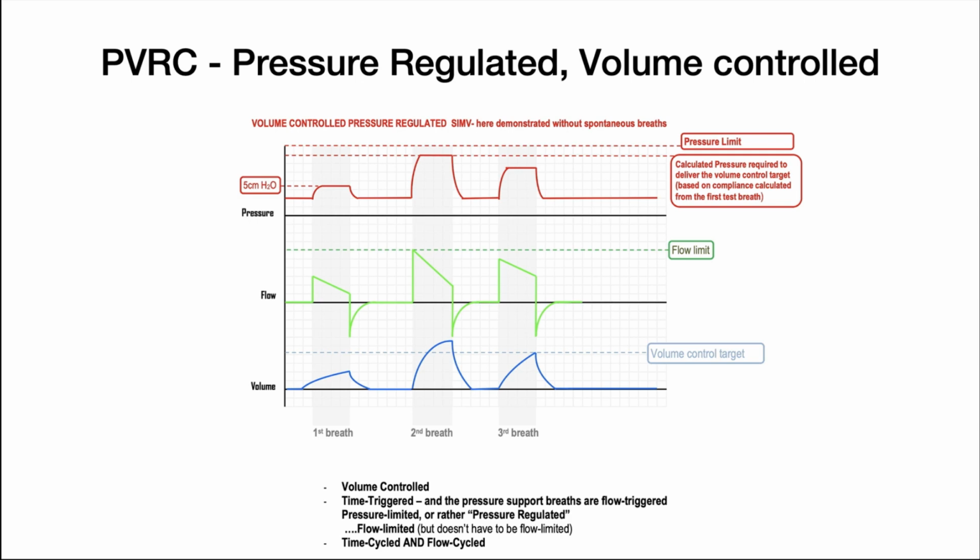If a target is not attained, the peak pressure is adjusted by 1 to 3 centimeters of water for the next breath. This allows breath-to-breath correction and enables increased airway pressure control. Because the inspiratory flow is auto-regulated, PRVC results in a lower peak airway pressure with a given tidal volume. Because the ventilator responds to a patient's effort in PRVC, as the patient's respiratory effort increases, the inspiratory pressure will decrease, therefore allowing for the patient's increased work of breathing.